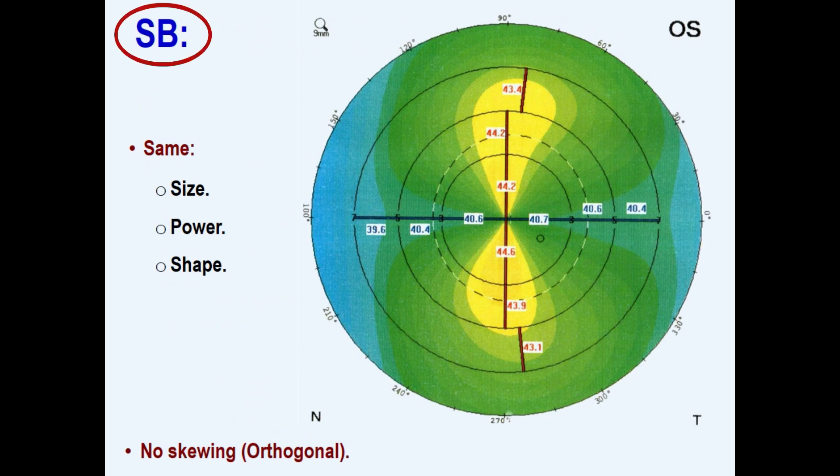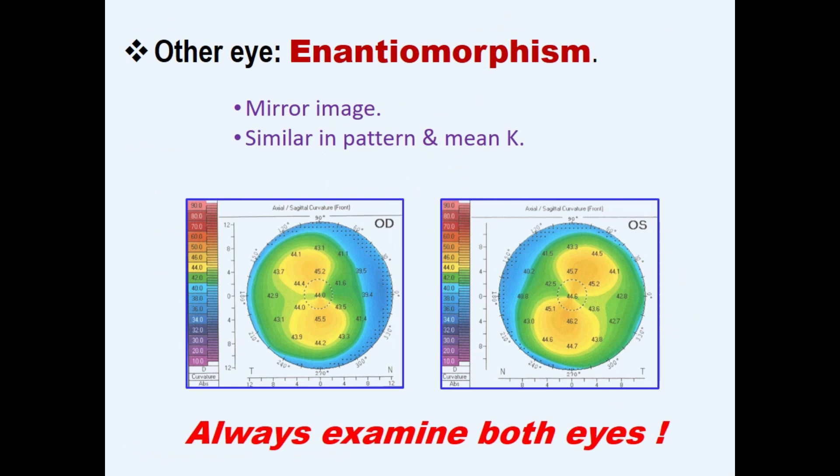Symmetric means both loops of the bowtie are of the same size, shape, and power. Topographies of fellow eyes tend to be mirror images of each other. This is called enantiomorphism. The difference in pattern and the mean K is small.